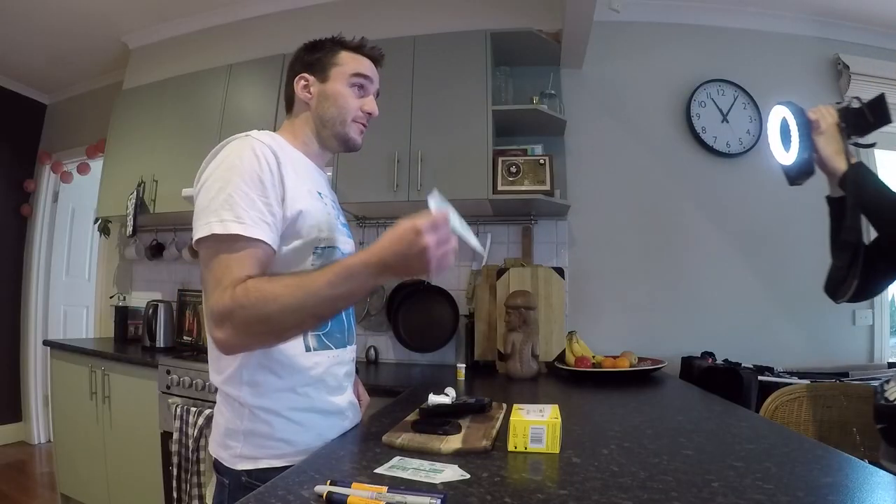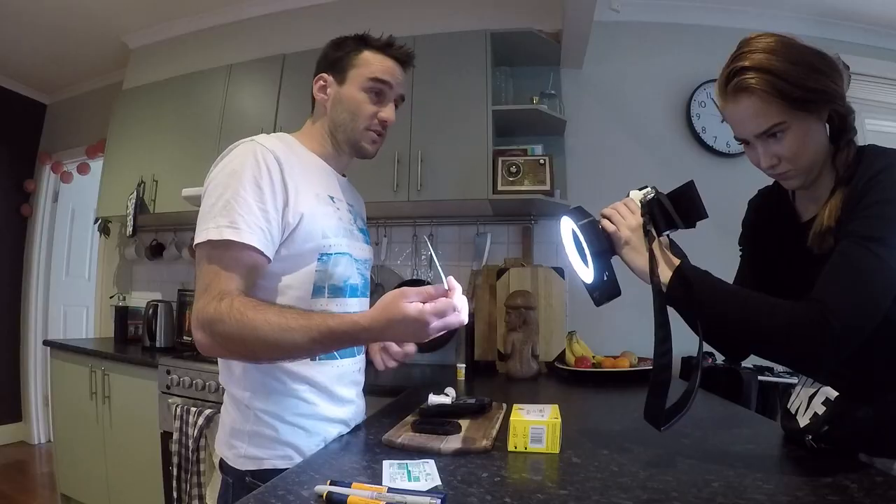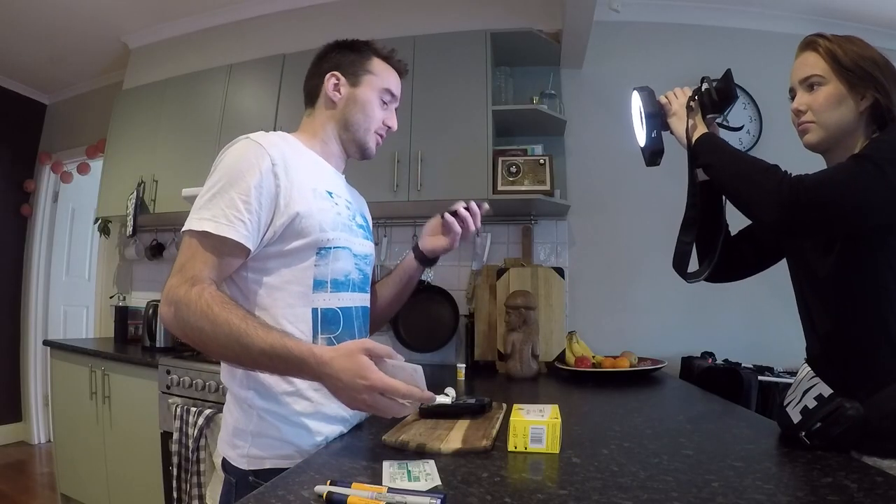I've just discovered Tegaderm film from 3M — the 1624W — which fits around the sensor and protects it a lot better. The experiment is: we're going to Bali for 12 days and I want to see if the Freestyle Libre can work the entire 12 days, and I also want to document how this blood glucose machine improves my diabetic lifestyle.